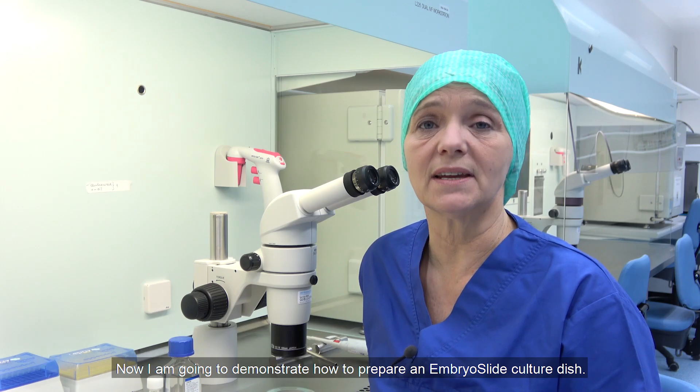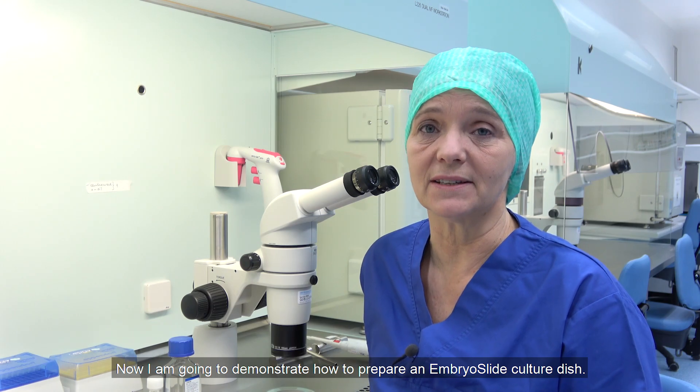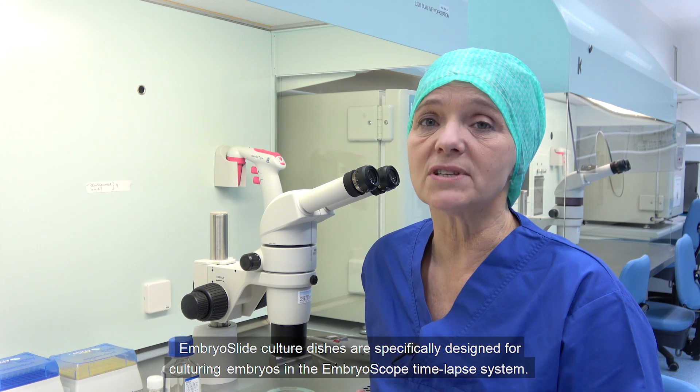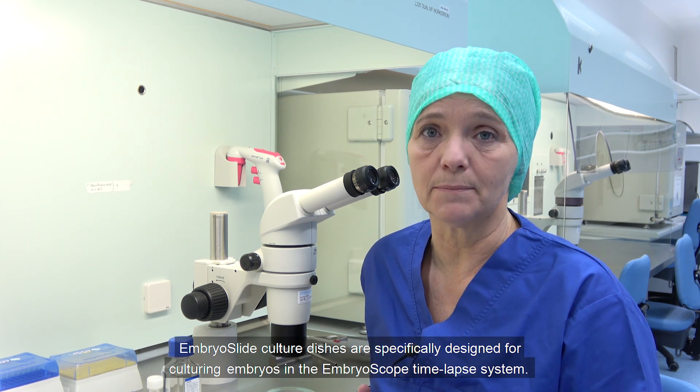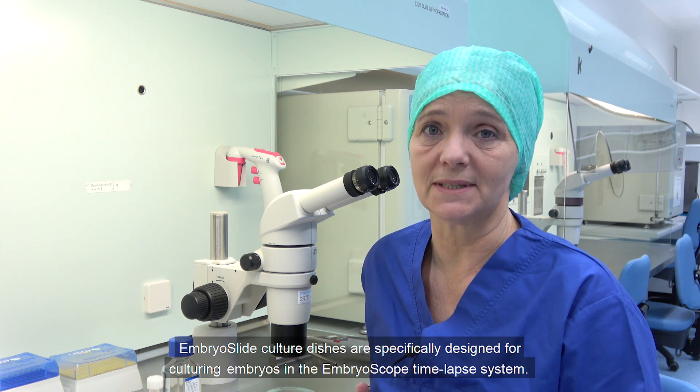Now I'm going to demonstrate how to prepare an embryo slide culture dish. Embryo slide culture dishes are specifically designed for culturing embryos in the EmbryoScope time-lapse system.